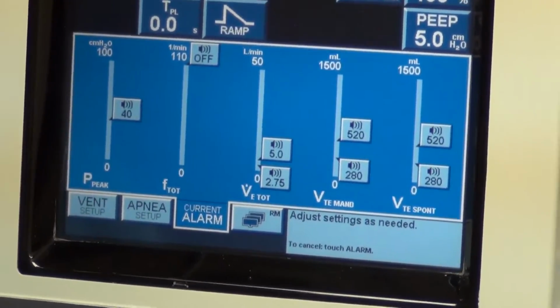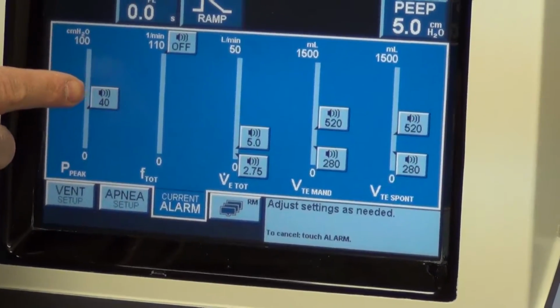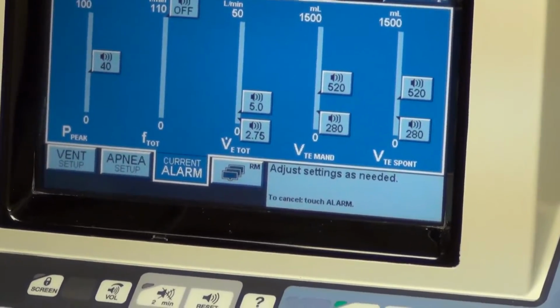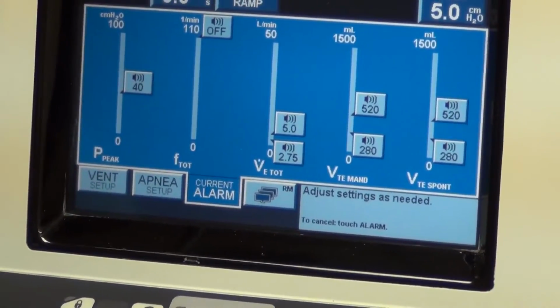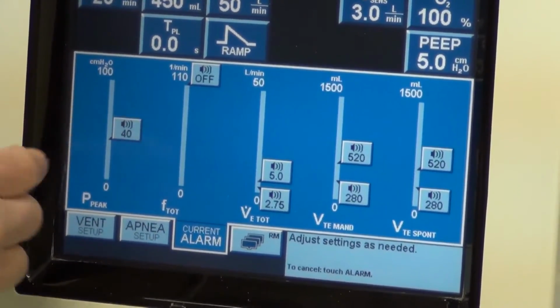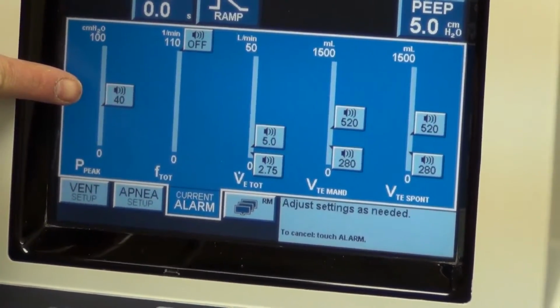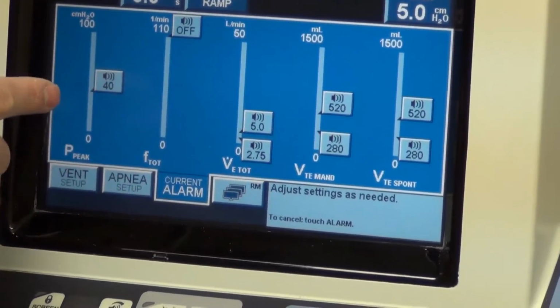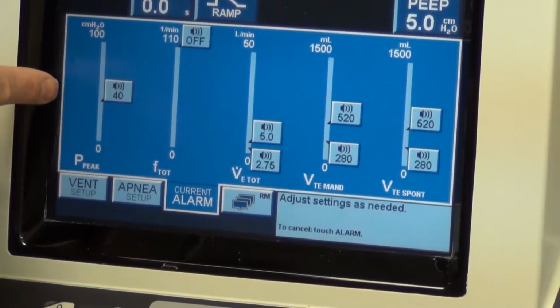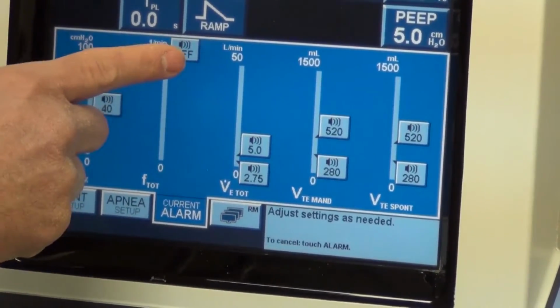We don't want to overventilate a patient, because if we ventilate him more than, for instance, 40 centimeters of water, we run the risk of creating a pneumothorax by popping a lung. So this is a very important alarm. When we turn the ventilator on, it automatically defaults to 40, and that's where I would keep it. There's certain circumstances, sometimes we change that, but for our intents and purposes, 40 is a good number.